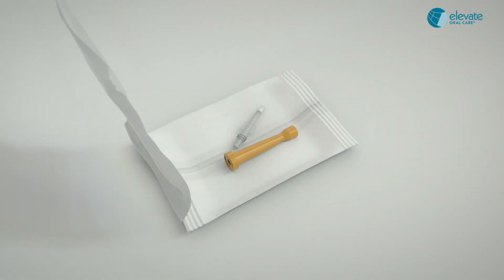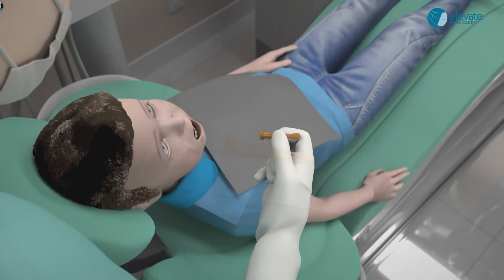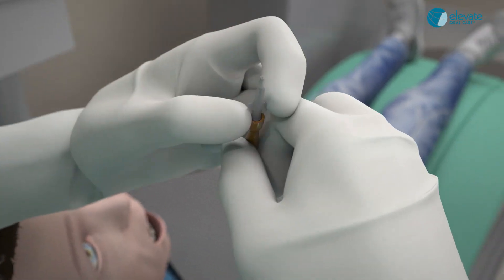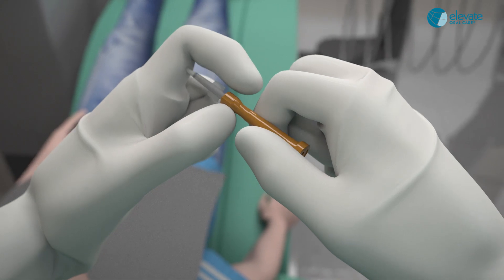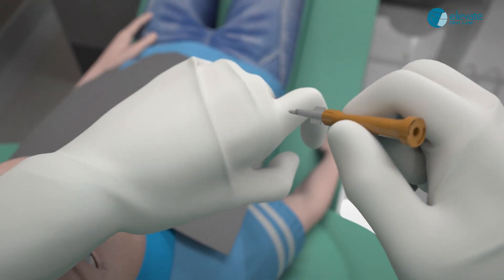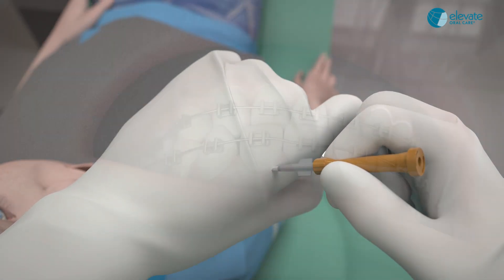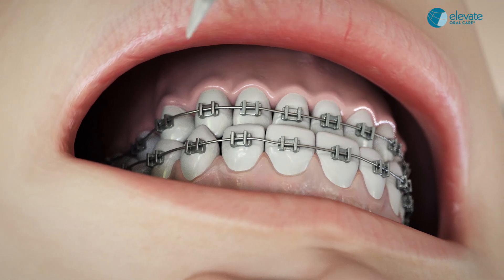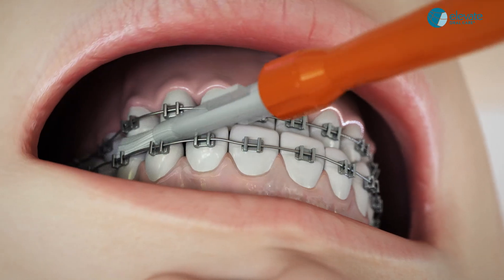Unit dose flow-through applicator application. Tear open the foil pouch to expose the brush and ampule. Shake the ampule for 10 to 15 seconds and then twist in the brush until you hear a pop. Hold the brush down and squeeze the ampule to wet the brush on gauze or the back of your glove. Keep the teeth moist due to the hydrophilic shellac. Follow the same three dispensing methods as described with the bottle delivery system.